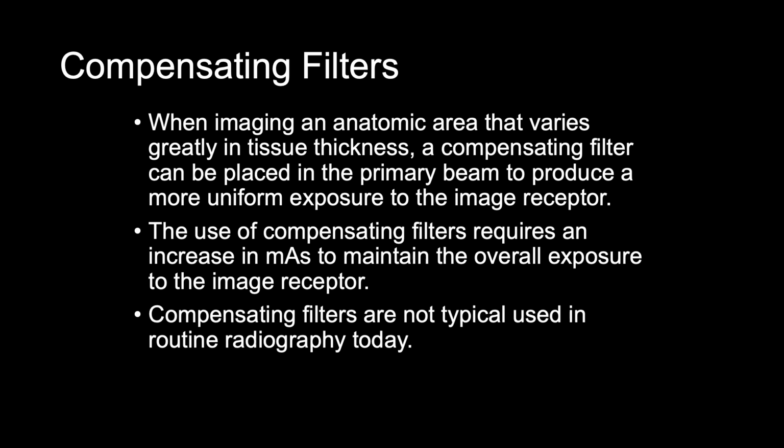So we'll use a wedge filter, and the thicker part of the wedge filter goes over the toes. So thick over thin. The thick wedge filter goes over the toes, and then the thinner part of the wedge goes over the foot. And then it'll give us more of a uniform exposure to the foot and not burn out the toes.